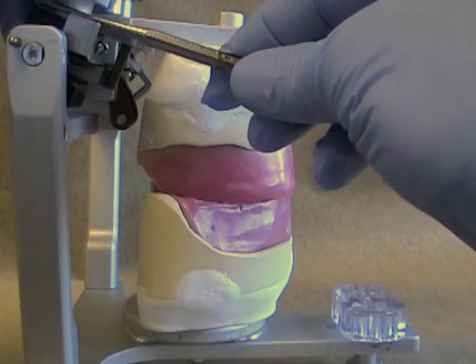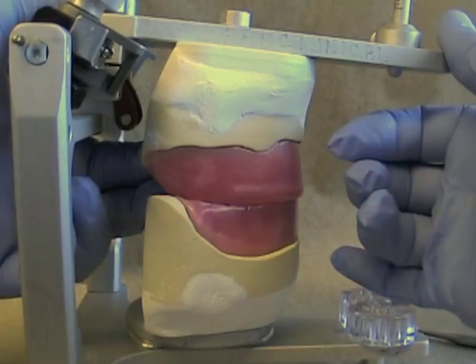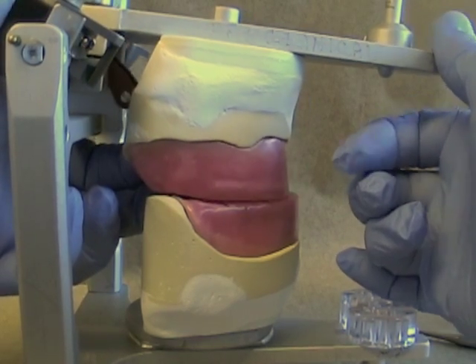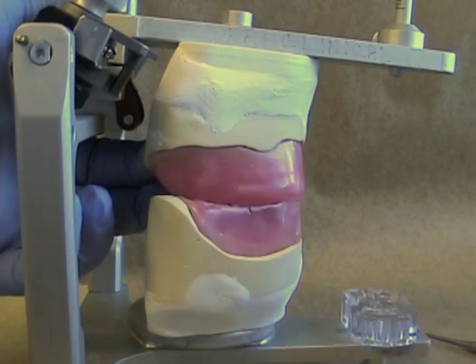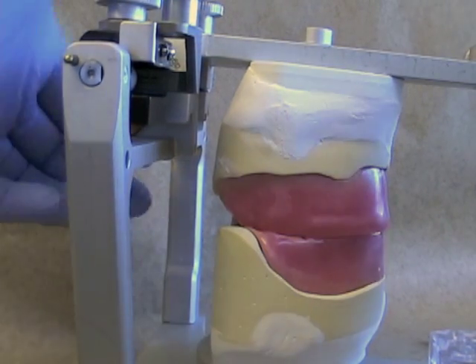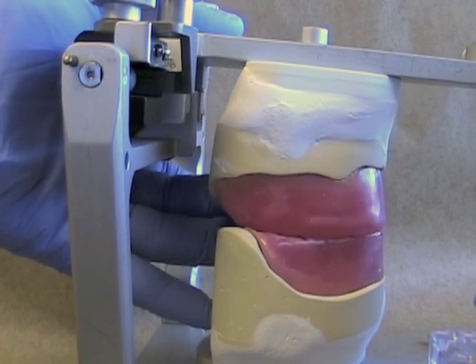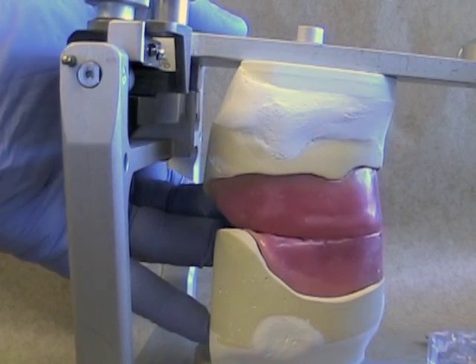Now let's shallow out this angle and see what kind of separation we get. Notice that as we go into protrusion, there is not as much separation in the posterior. This is because the condyle doesn't have to move down as far because the angle is not as steep. If we zero this out so it's almost flat, you'll notice that as we move into protrusion, there is almost no separation of the maxillary and mandibular rims.